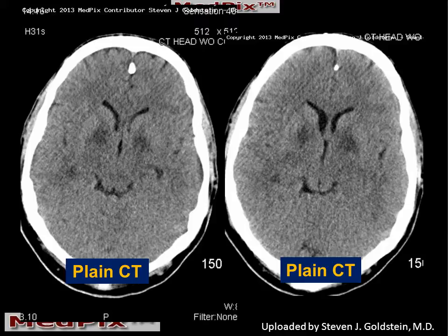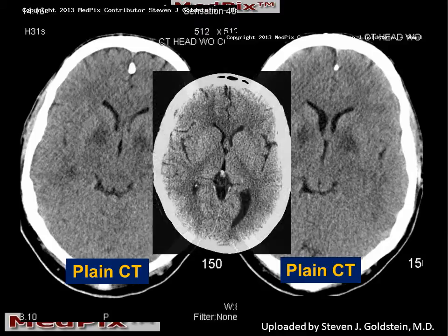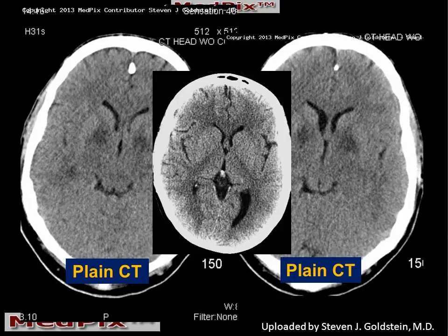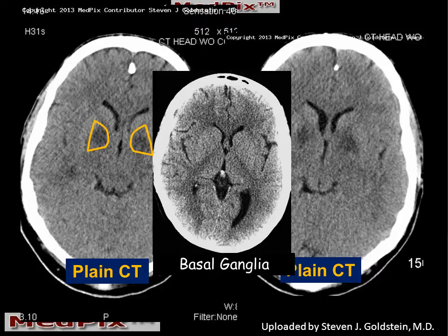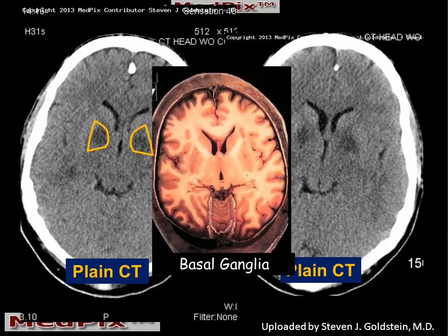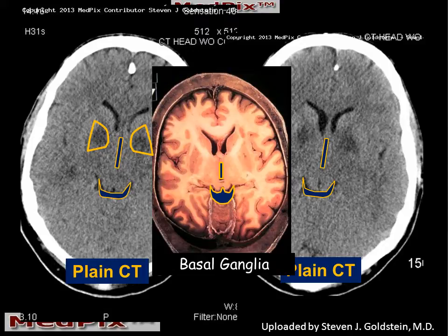These two slices, both at the level of the quadrigeminal plate cistern, are clearly abnormal. In the center, we have a normal slice from a similar location, and we can see on our images that there is abnormal decreased attenuation in the medial portion of the basal ganglia. Which portion of the basal ganglia is this? If we look at this brain slice, we can see the anatomic landmarks of the third ventricle and the quadrigeminal plate cistern, which we can also identify on our scans.